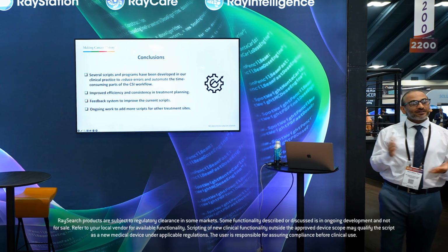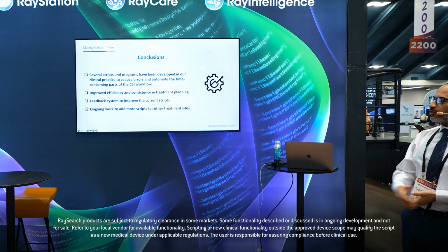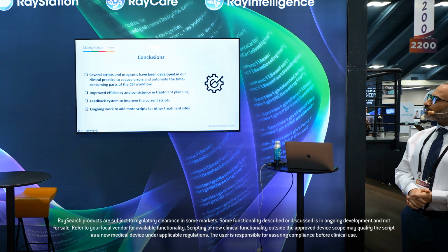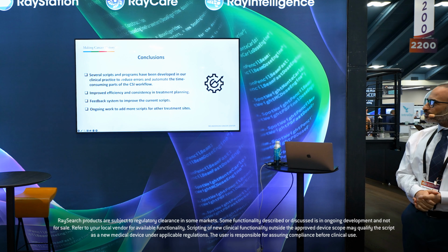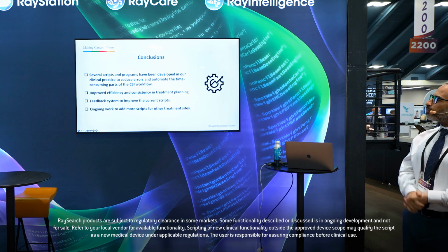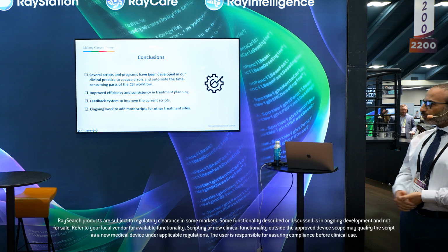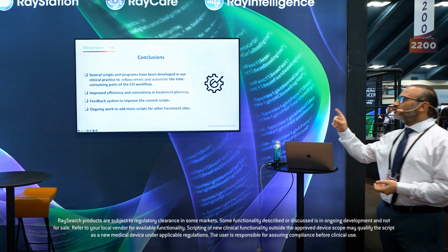So I'm done here. I just want to say the conclusions of our work. Several scripts have been developed at MD Anderson to reduce errors and automate the time-consuming and error-prone parts of our CSI workflow. And this has improved the efficiency and consistency.